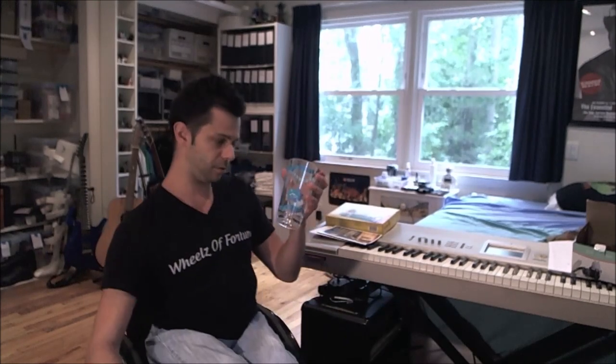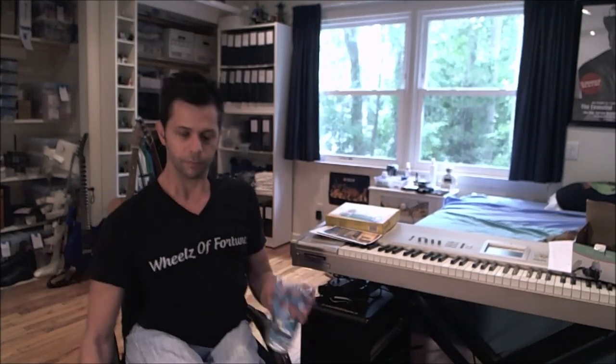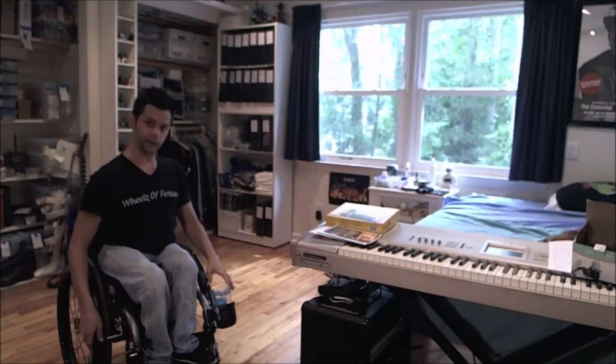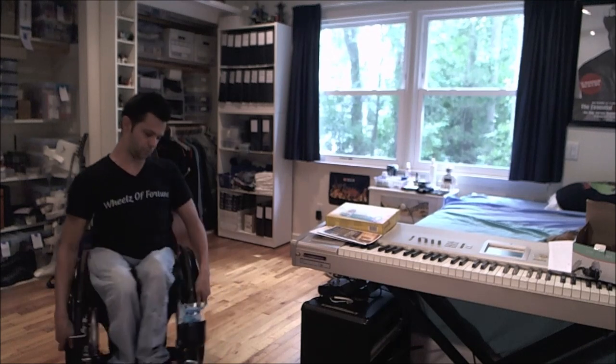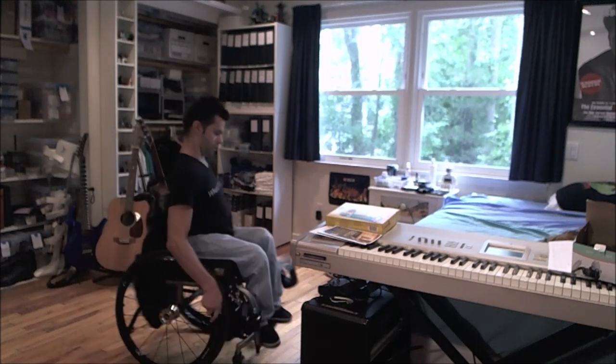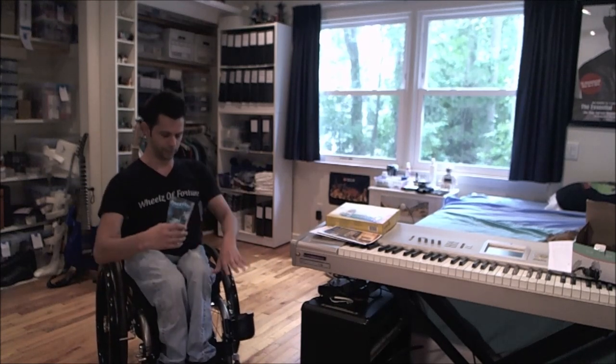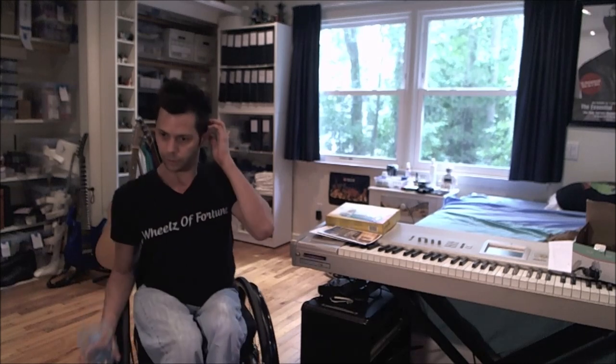So I have this plastic cup — we've got fish on it. I've had this for years and years. Again, really nice fit. You can sort of do spins or whatever. Obviously if you have liquid in here and you do stuff like that it might come out of the cup, but that's not really an issue with the cup holder. It comes out nicely.